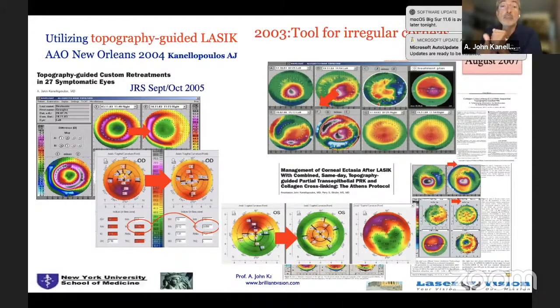We're able to treat, on the bottom middle, a cornea irregularity that came through a cornea infection. And usually scarring creates significant inferior flattening. It's as if we're looking at a keratoconic eye upside down. So the cornea here is steeper on the top, flatter on the bottom, because that's where the scar took place. And we see the picture next to it. And this is, I'm putting my arrow on the middle bottom picture, how the topography-guided technology was able to magically shift this.